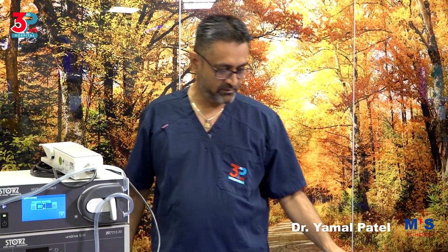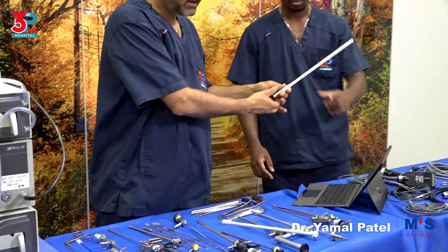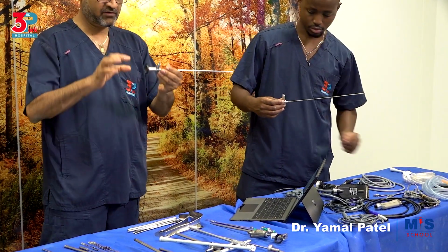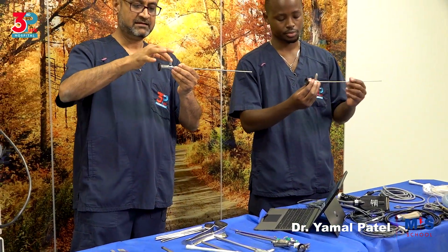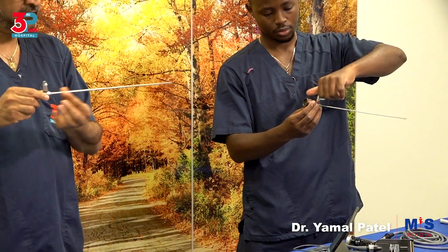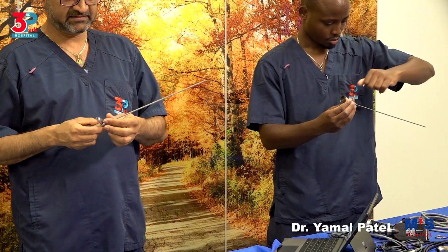Now we go into the instruments one by one. So we are starting with the telescope. So this is a telescope. A telescope consists of the eyepiece, the light adapter, the barrel, and you have the objective lens.